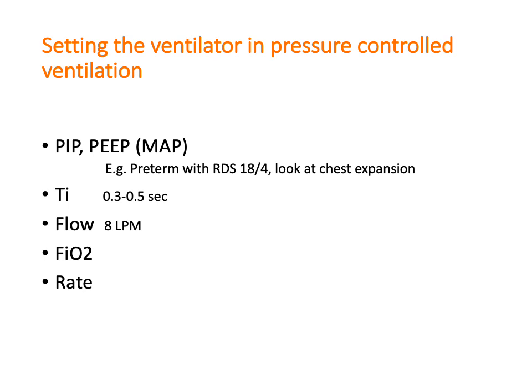So coming to the settings in the ventilator, as we said previously in the initial curve, the settings are mainly the PEEP and the I time, which usually is 0.3 to 0.5.